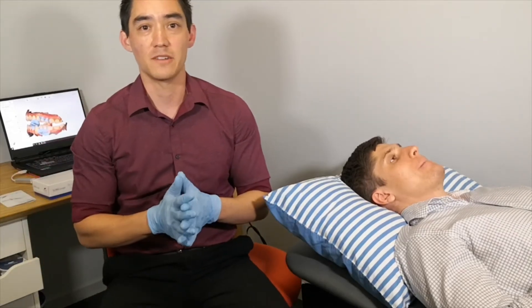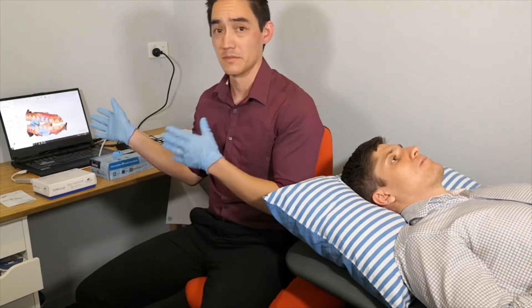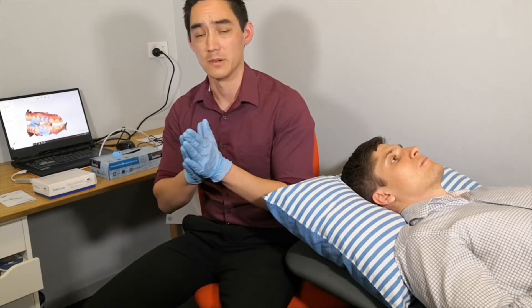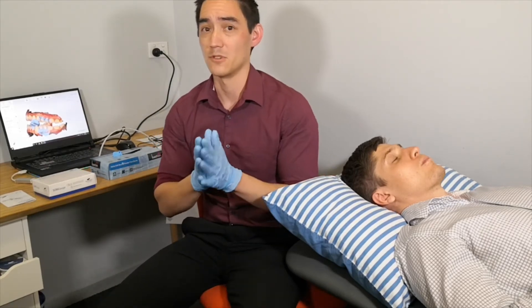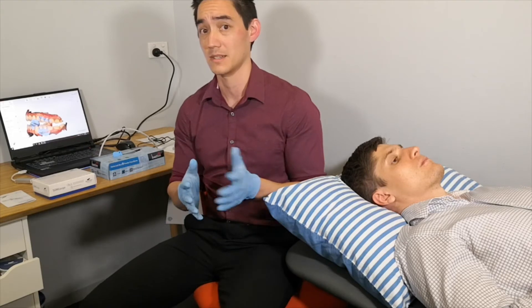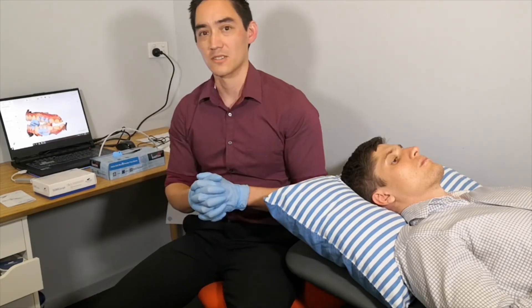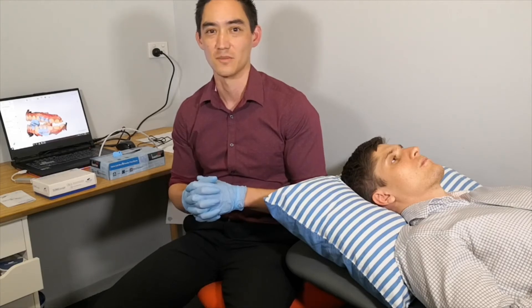So there you have it — that's how we do the bite registration for the records. That's all lined up on the computer. You can assess it before the patient gets up to make sure you have it and that the midline looks correct. You need roughly around three millimetres of vertical clearance all around the arch. If there isn't enough, the lab can open it up for you. Otherwise if you prefer to do it yourself, I suggest doing the bites again but changing the vertical ramp to open the vertical dimension up a little bit more. So now we will send this down to SomnoMed to begin construction of the SomnoDent appliance.